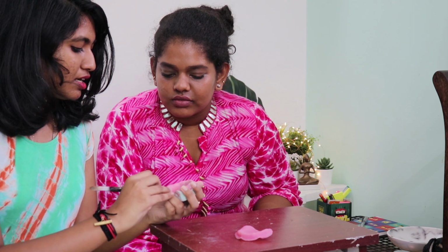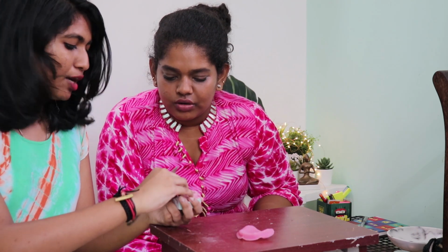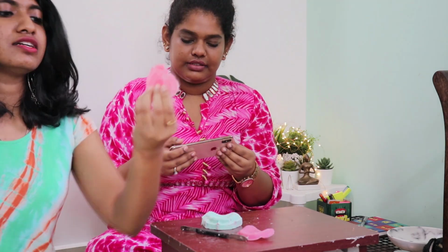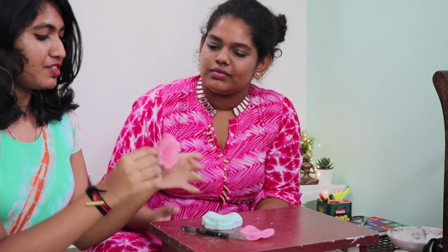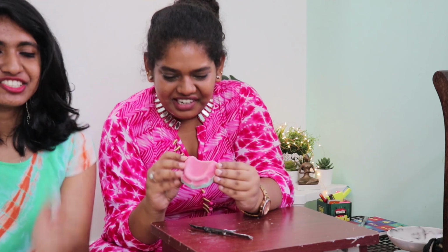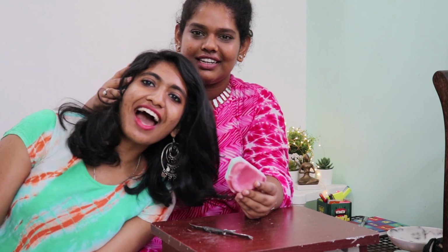If it is hard, like this, it won't come out that easily, okay. Now it has come out like silicone. You see, it's so flexible like that. But if it's dry it will be better. That is it. What did I do first? Denture base. I did the maxillary denture base first.